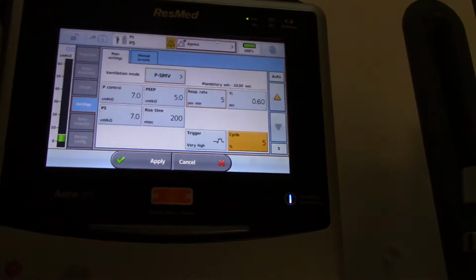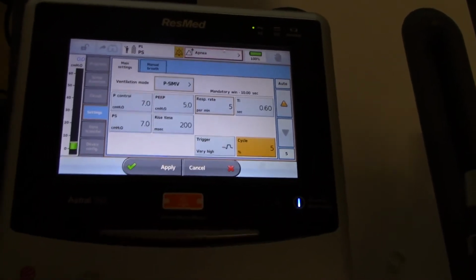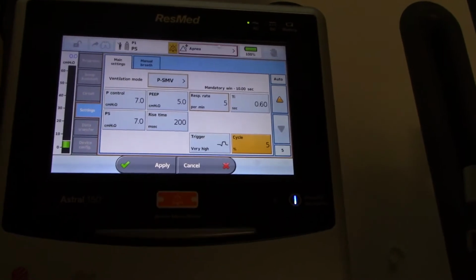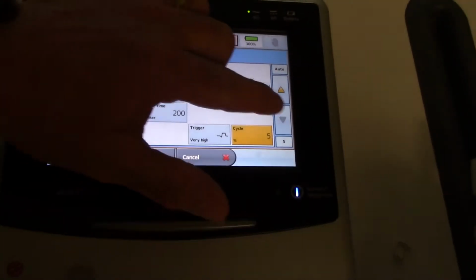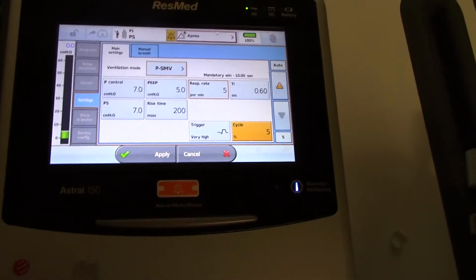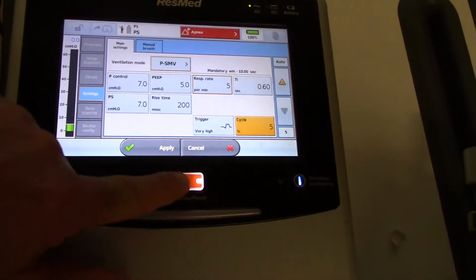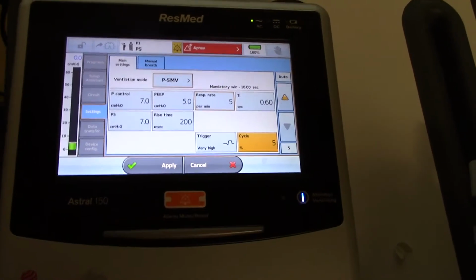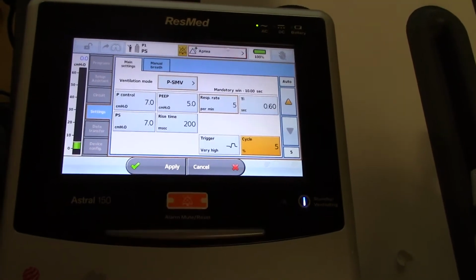Our percent cycle, we're going to set that just like we do on the servo. However, the servo will go down to 1%. This vent will only go to 5%. So the shortest you can have that is 5%, and that's what we're going to want it at on this, just as we do the 1% on the servo, and you're going to adjust that with the same practices you do on the servo.